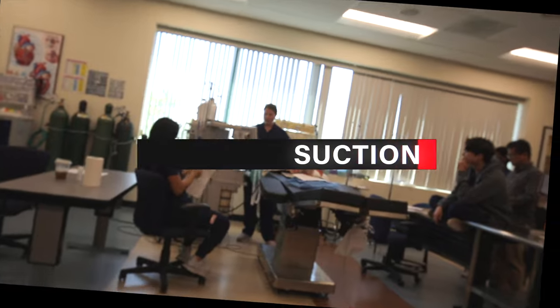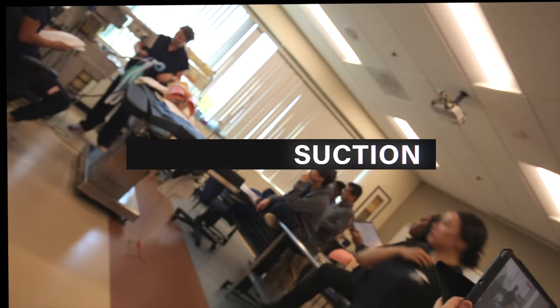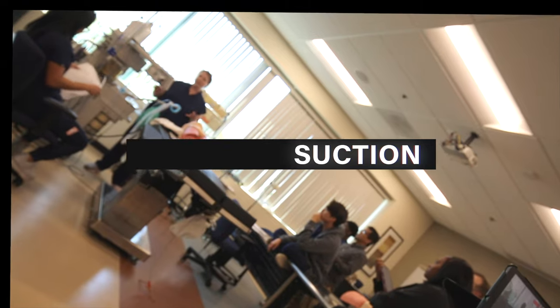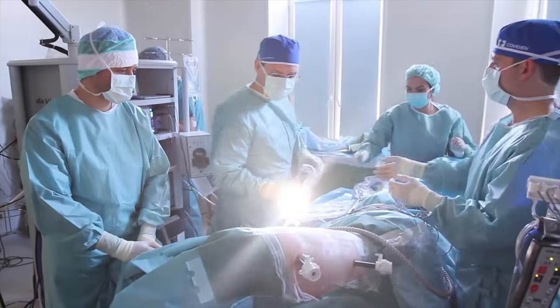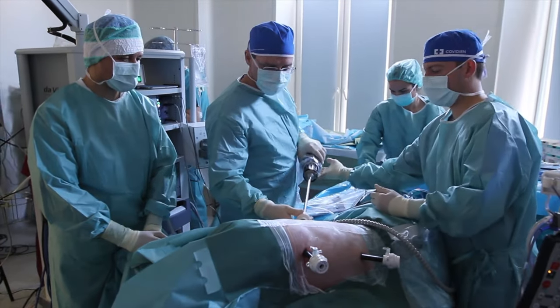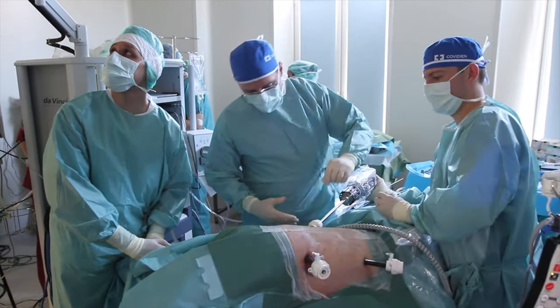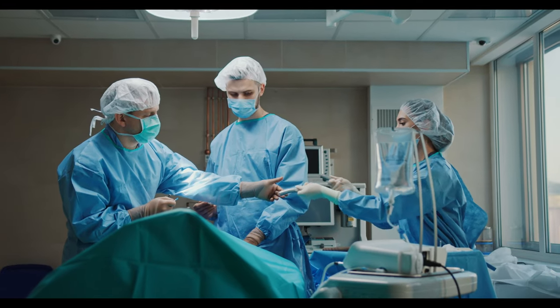Suction, troubleshooting suction. If you don't hear the hissing sound, it is not on. So if you don't hear a hiss, you have to troubleshoot. Sometimes it's just as simple as flipping a switch, other times you really have to follow the tubing all the way back and make sure that all of the pieces of the canister are connected and firmly sealed or seated in the little holder that it sits in. And every now and then there's a little dial that is like a valve that opens up the flow from the manifold.